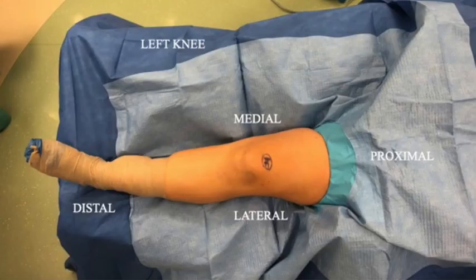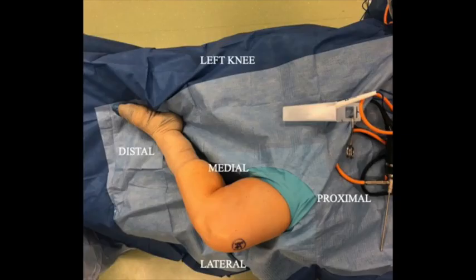The case starts with the patient positioned for standard knee arthroscopy per surgeon preference. Our preference is to perform the surgery under tourniquet control with the patient positioned supine with the leg in a figure-of-four position to allow increased access to the lateral compartment.